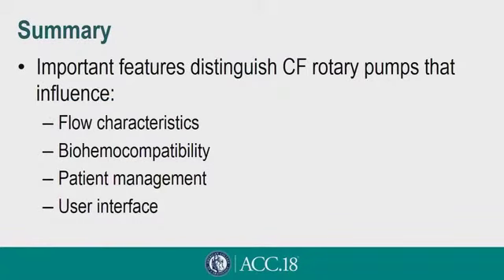So in summary, there are important features that distinguish continuous flow rotary pumps, and that includes flow characteristics, biocompatibility, and also ways of informing patient management and important differences in user interface.